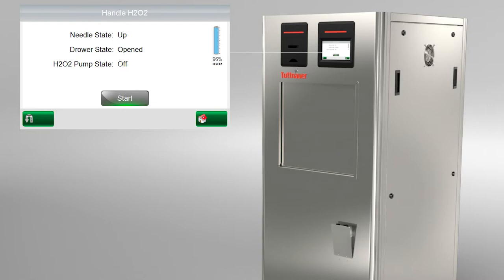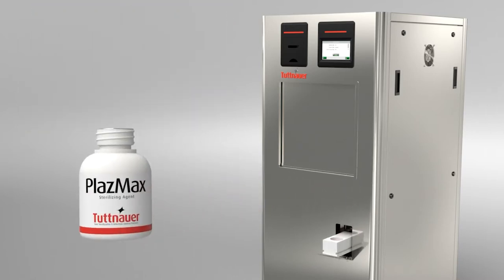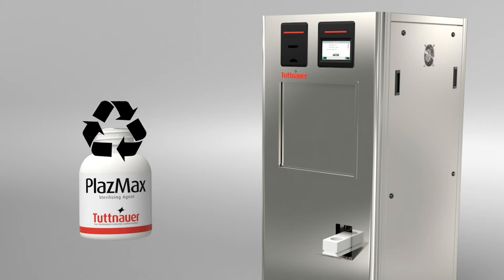The screen shows the increase of the agent level and at the end the drawer opens with the empty bottle inside. Remove the empty bottle while wearing gloves and recycle it according to local regulations.